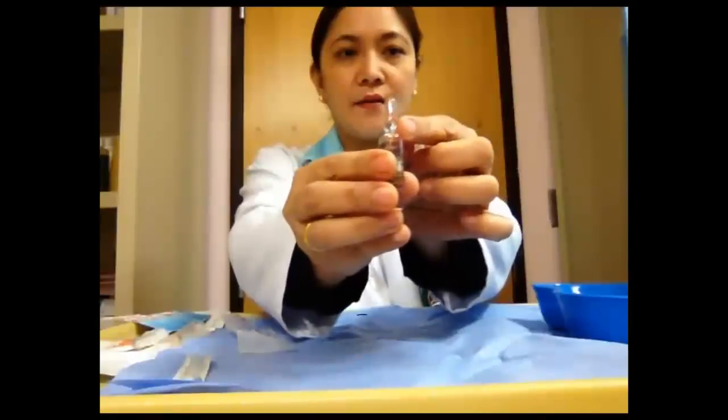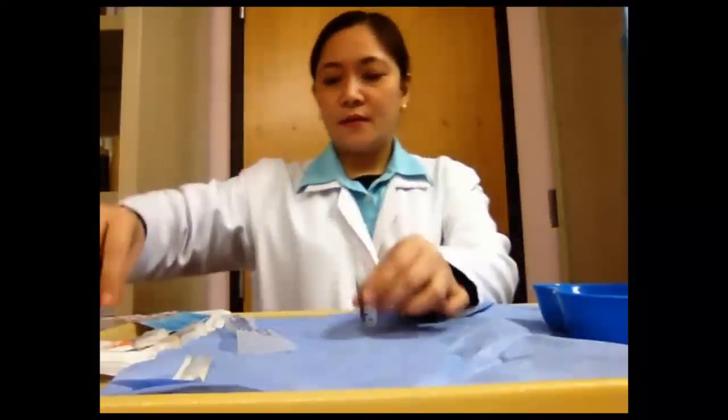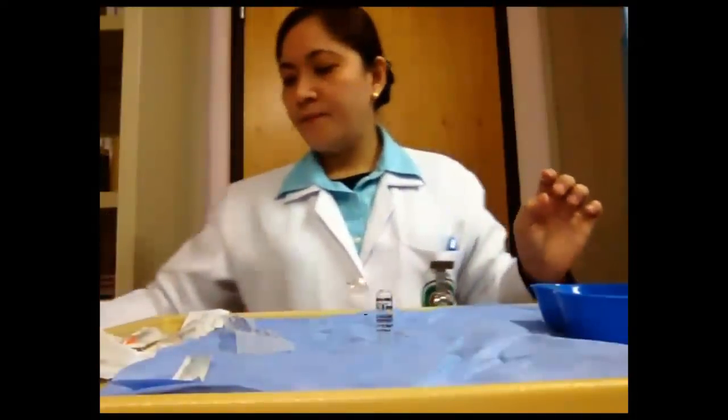Now, I'm going to prepare medication from the ampule. You have seen this red dot on the ampule. It indicates that on this part you are going to break the head of the ampule. Use a clean gauze to protect your finger from breaking the ampule. Now it's open, and discard the head part of the ampule.